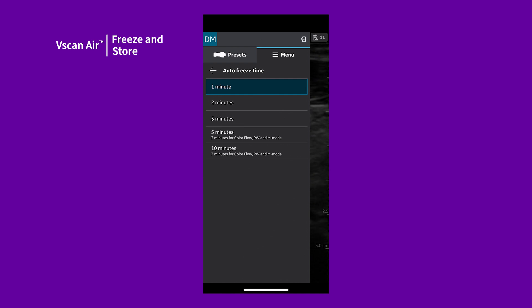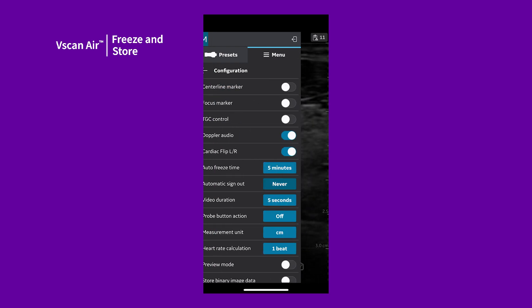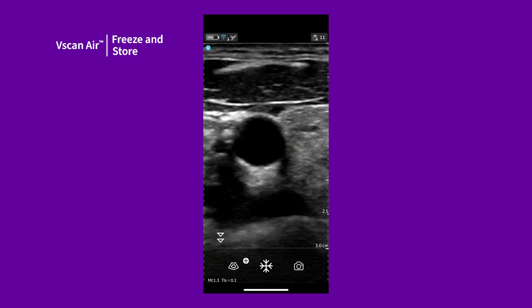When scanning in pulsed wave Doppler, the system will auto-freeze after 3 minutes. It's important to note that a connected probe continues to use battery even when not actively scanning.